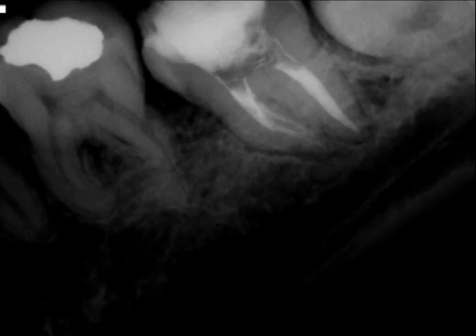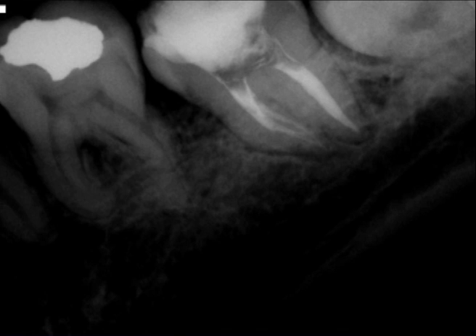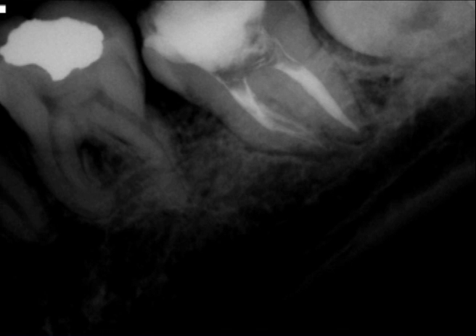If you go around the other canal, you can easily bypass it. Here's another angle showing that. I was pleased with that result.